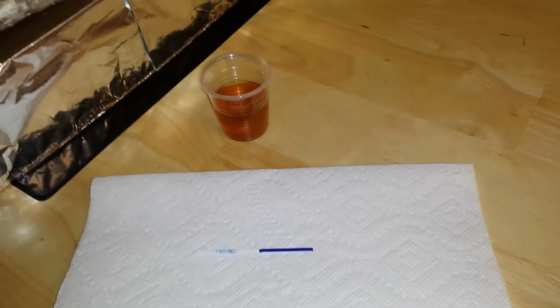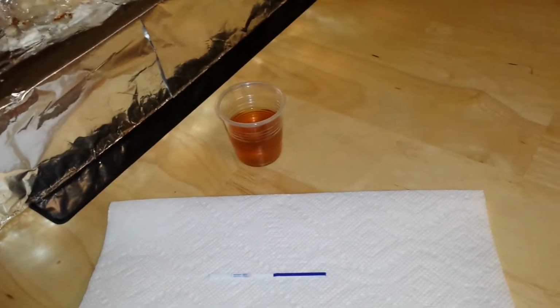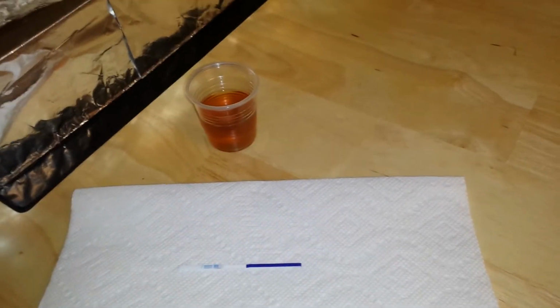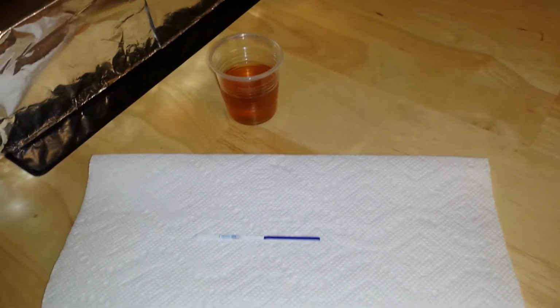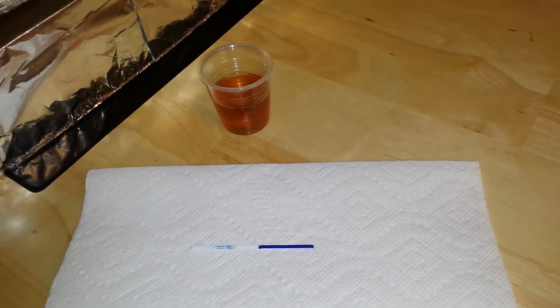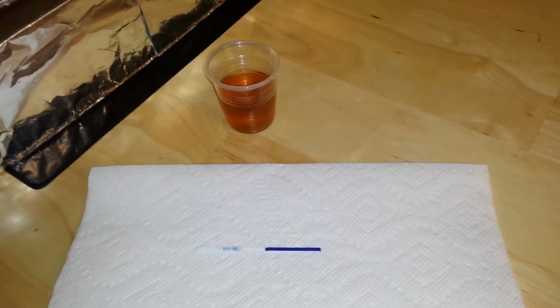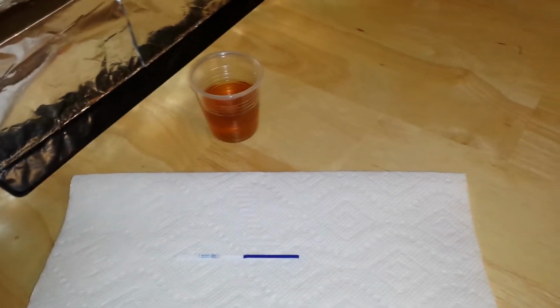So please, ladies, stop throwing out the word evaporation as if any line that may not be dark enough, may not be pink enough, is automatically an evaporation line. They do not appear on a wet test. It is impossible for an evaporation line to appear on a test that is still wet. I just wanted to go over that with you real quick because it drives me insane. So that is the true definition.